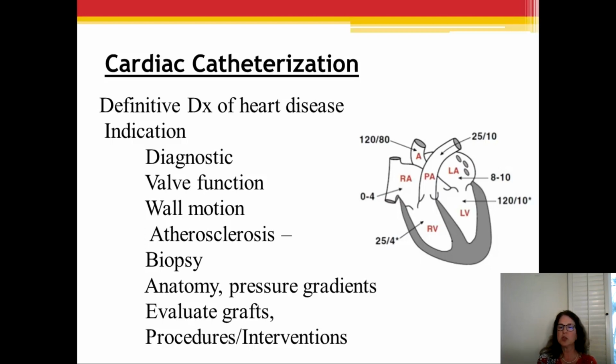And certainly procedures and interventions. And a lot of those are pediatric. And I'll show this toward the end. But certainly even for adults, we're going in and we're ballooning a vessel, which would be the most common things. We're putting a stent in place. Balloon angioplasties, ablations, is literally like, let's say I have severe pulmonary stenosis at the valve. Well, you don't have to have a pulmonary artery valve. They may just go balloon that and crack it open and open it better.